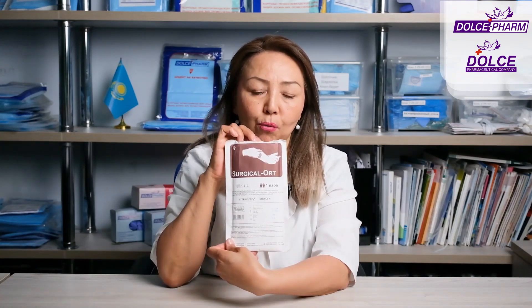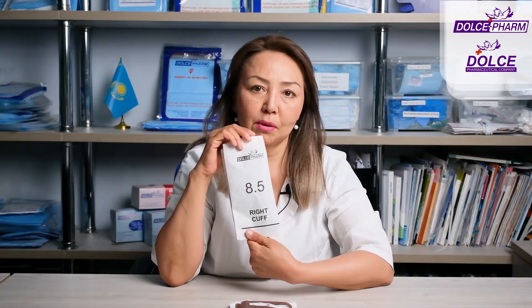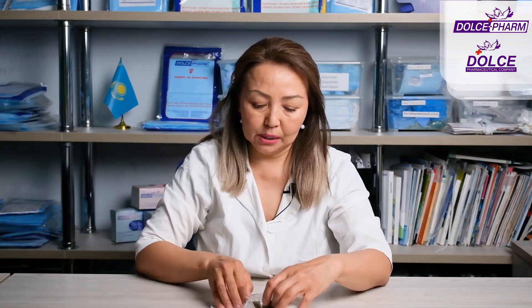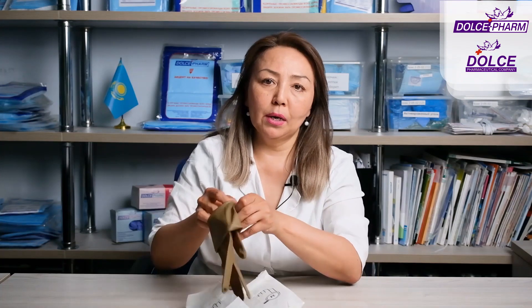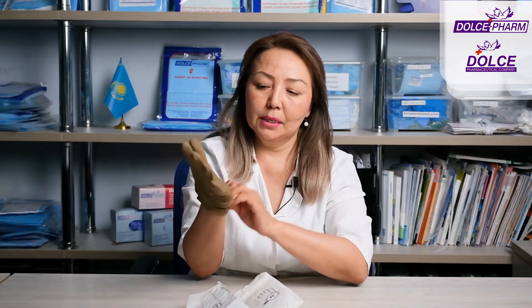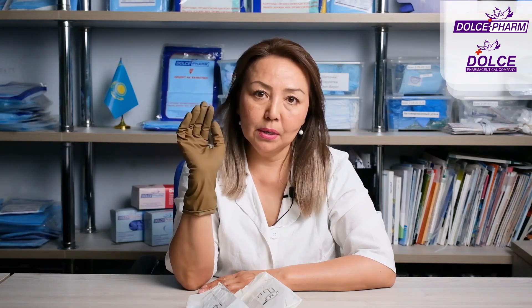This is what the packaging of Surgical Ort gloves looks like. These are size 8.5. For medical gloves, size is measured by the width of the palm without the thumb, and our surgical gloves are available in 10 sizes. Notice the color — they are brown, matte. This is so that when performing surgery on the bone, they stand out against all the white colors, helping to ensure the safety of both parties.